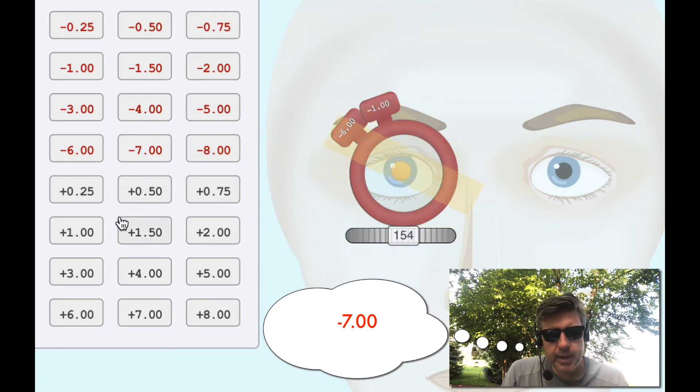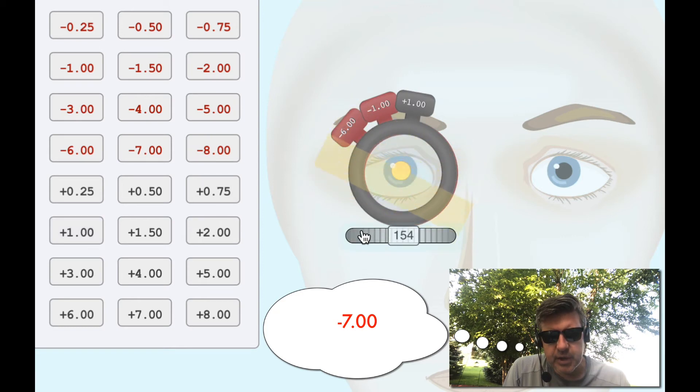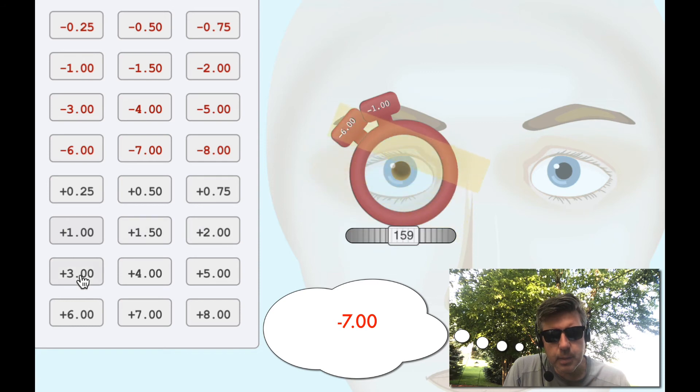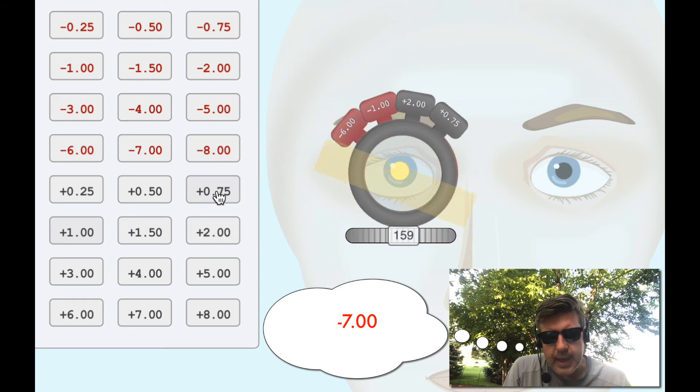So minus seven — let's add plus one. I can refine this axis a little bit more. Let's make it plus two. That looks pretty good. Let's make it plus three. Okay, that looks like a little bit of against motion. So let's go back to plus 275. Yeah, that's neutral. That's neutral.